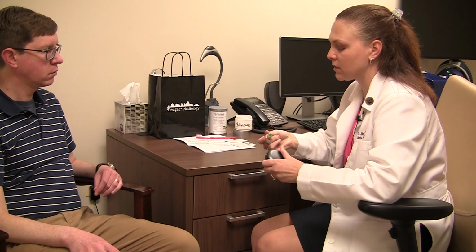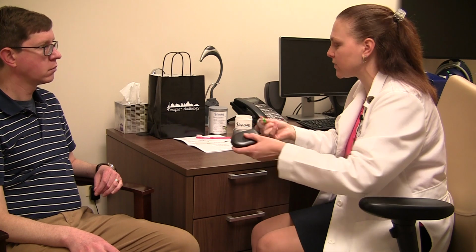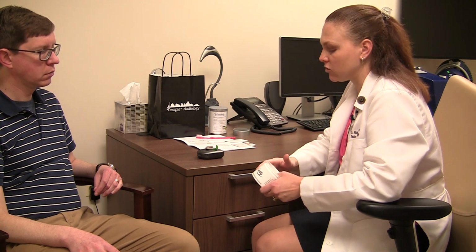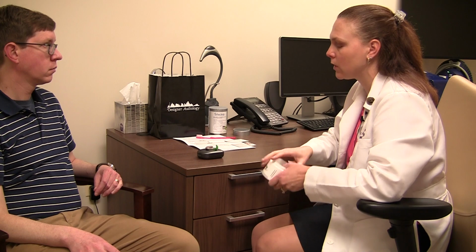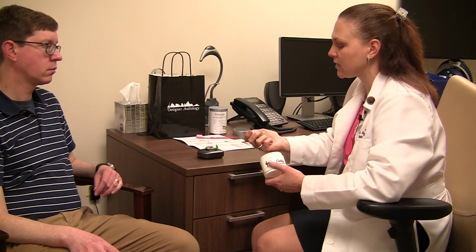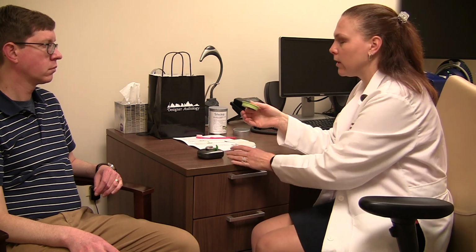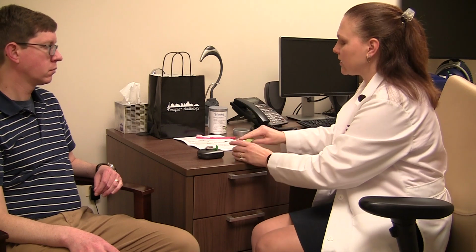So this is the case that if you have to take your hearing aids out during the day, you've got this case to use. When you go to bed at night, I want you to use this system. This is called the Dry Caddy, and it's just a dryer to help take out any perspiration, humidity, oil, sweat, anything that might have gotten on the hearing aid from you using it during the day. So inside this little plastic container is a desiccant disc. And the desiccant, as you probably know, is just going to pull out any of that moisture. So we're going to put the disc in here.